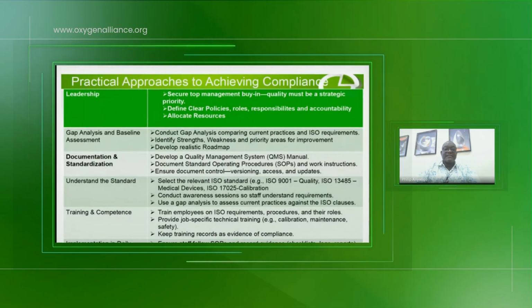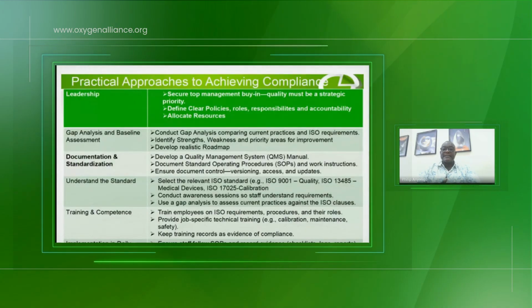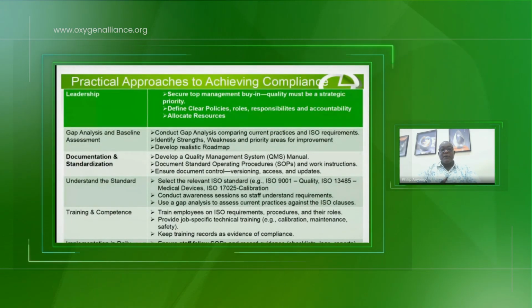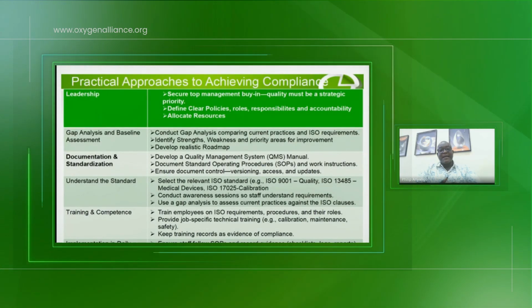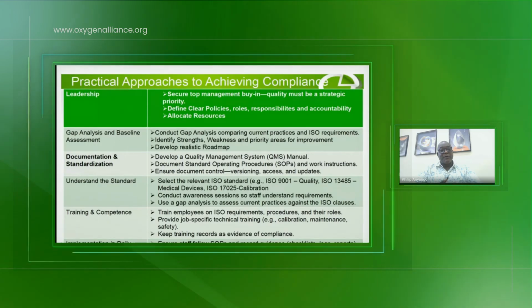Then you do gap analysis, the baseline assessment. When we do baseline assessment, we conduct a gap analysis comparing current practices and ISO requirements. We identify strengths, we identify weaknesses, priority areas for improvement, and we develop a realistic roadmap for implementation of the ISO that we are talking about.